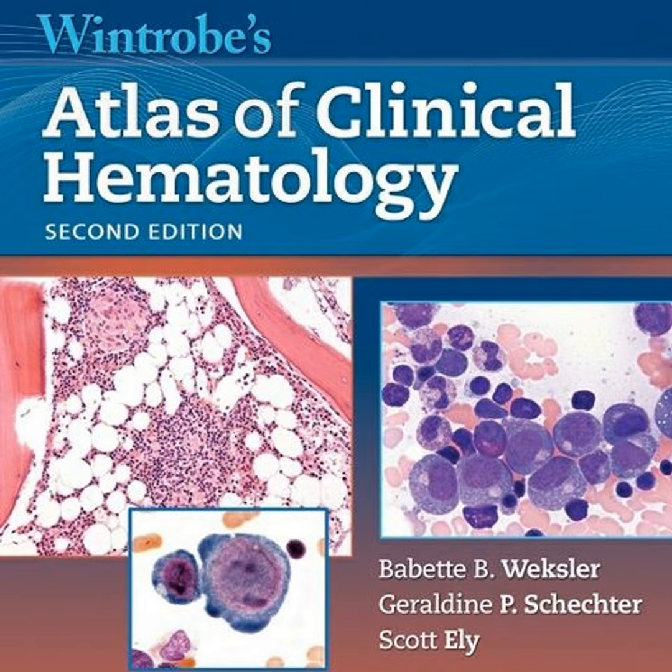And this requires your eye. You have to specifically identify what you're seeing. Are they target cells? Teardrops? Elliptocytes? Or, and this is a big one, are they schistocytes? Those little fragments that scream microangiopathic hemolytic anemia. You also have to spot inclusions. Things like Howell-Jolly bodies.